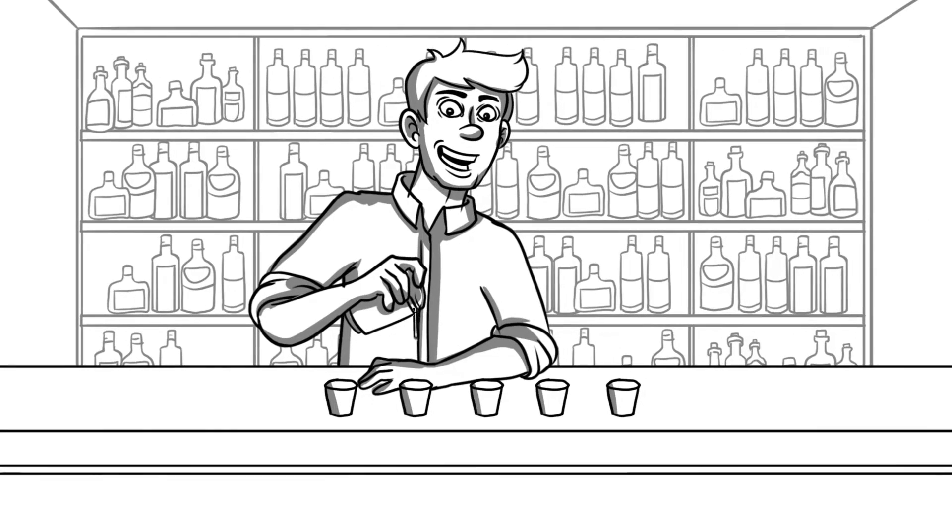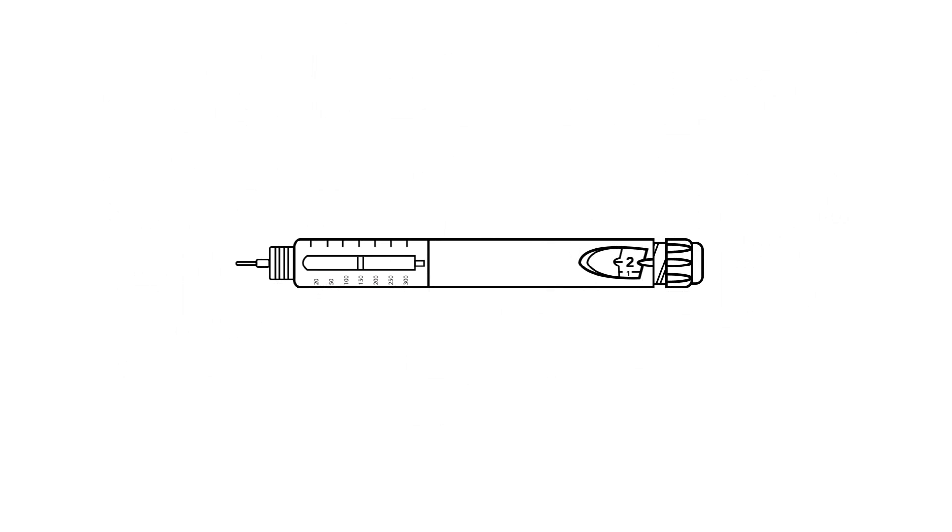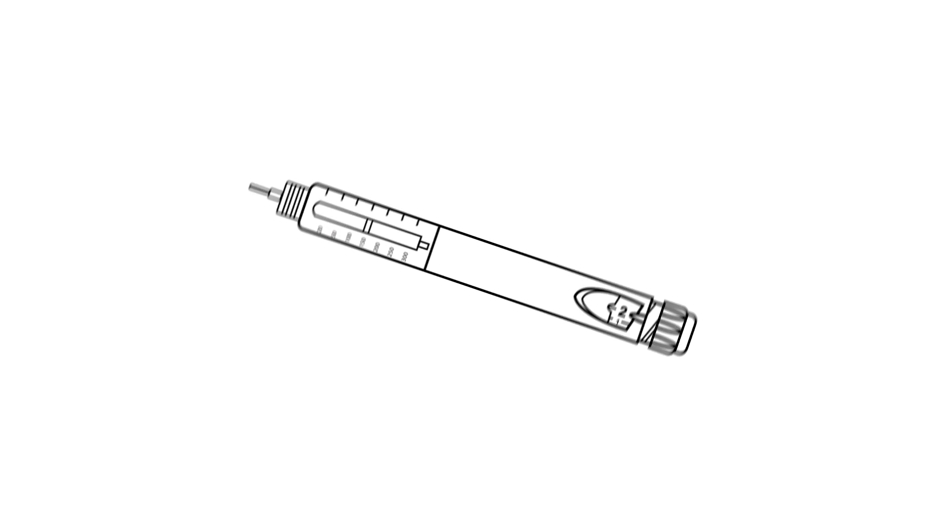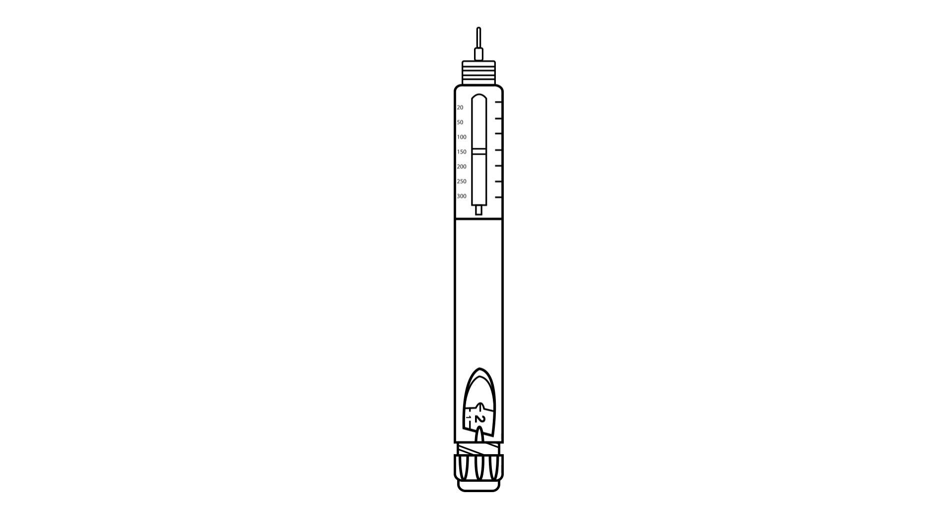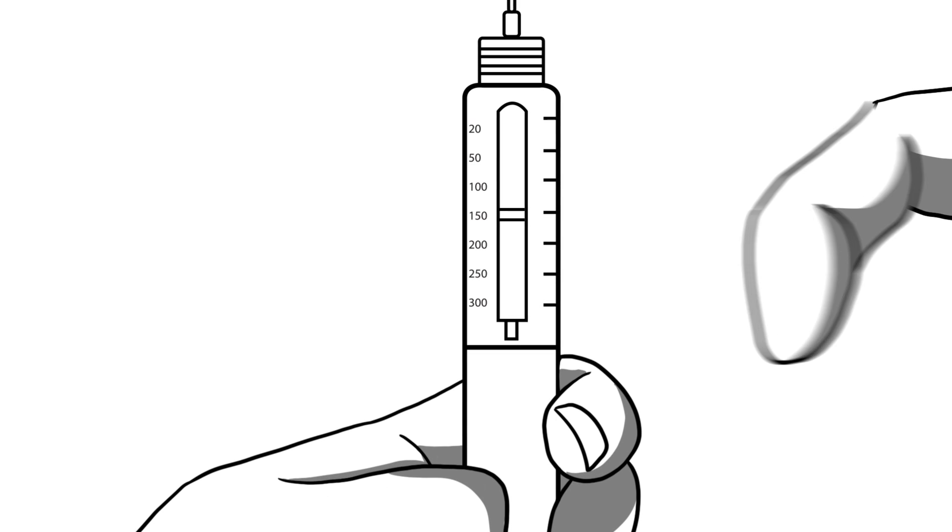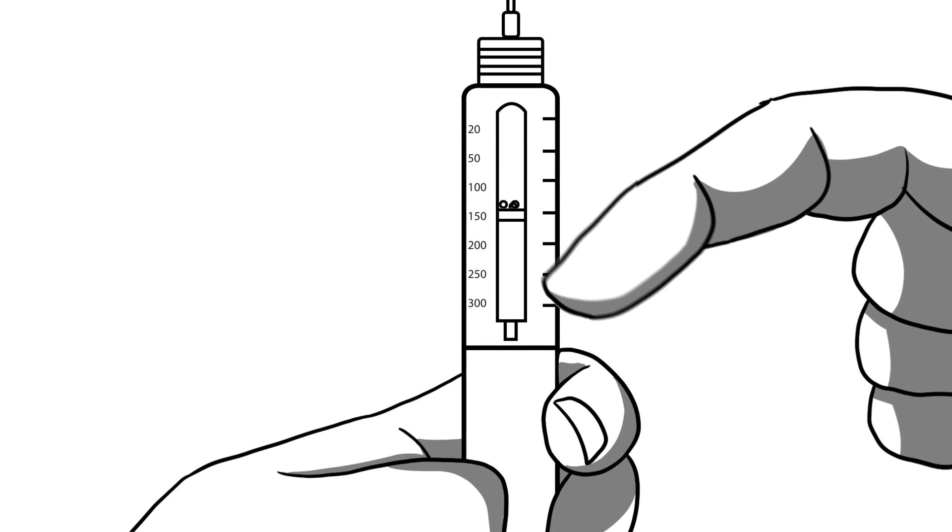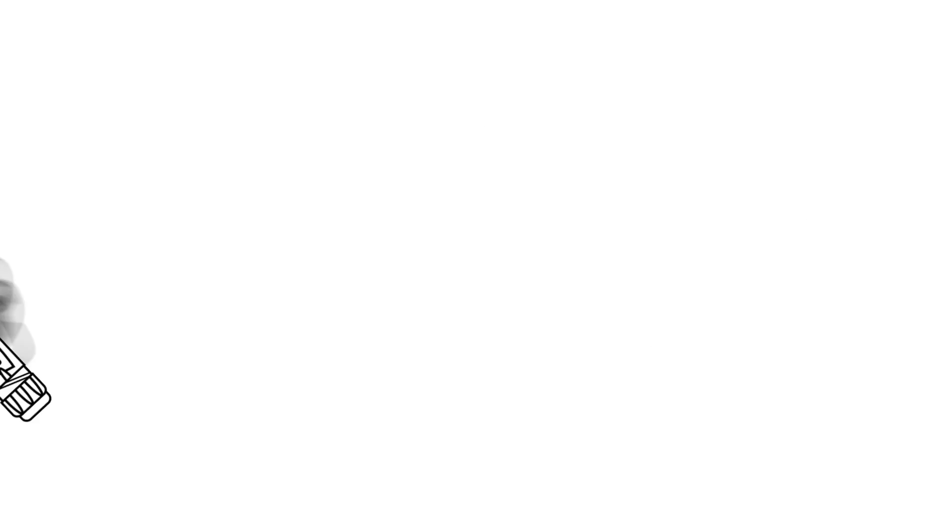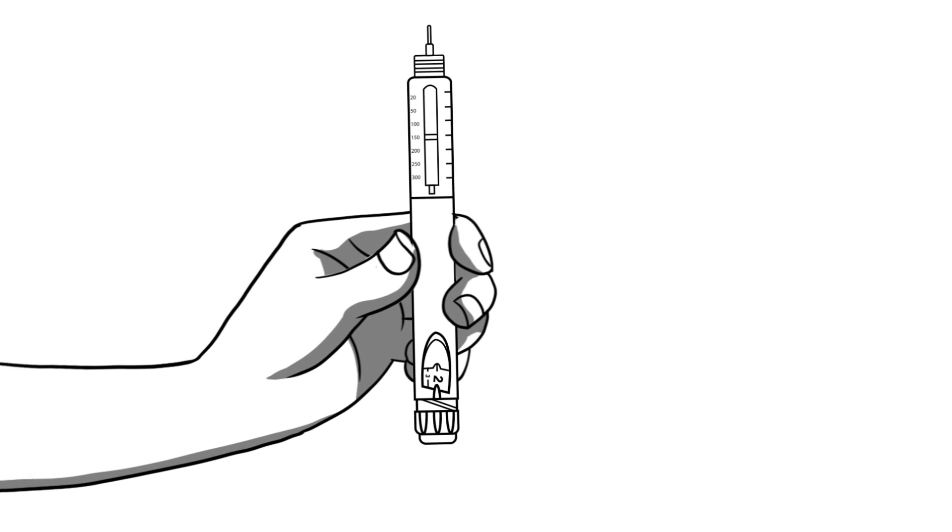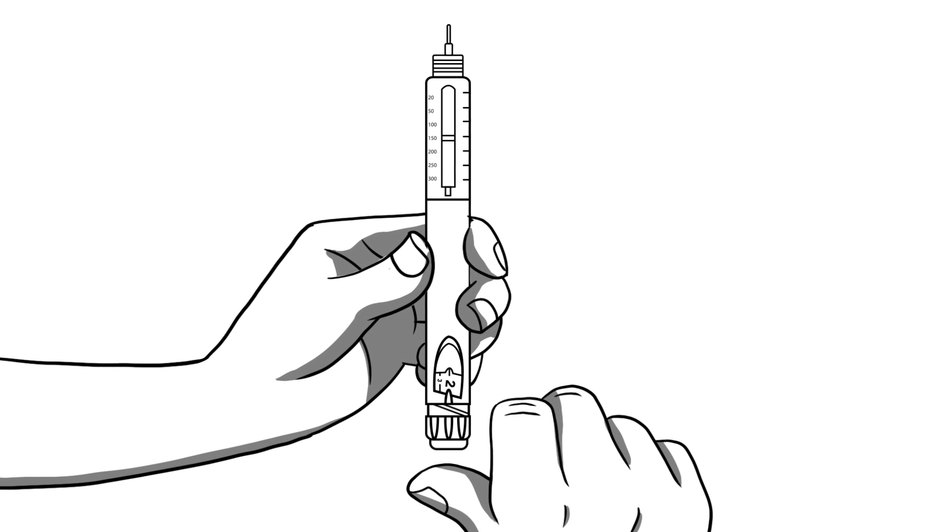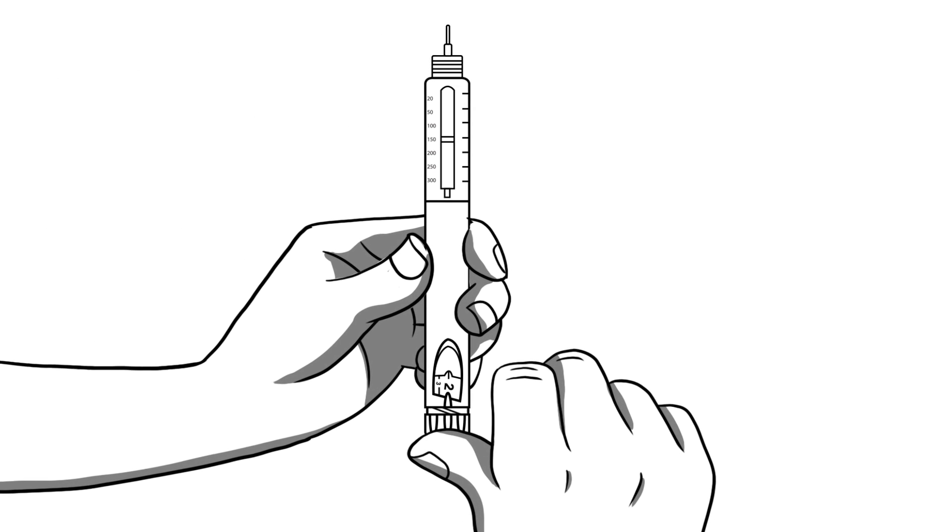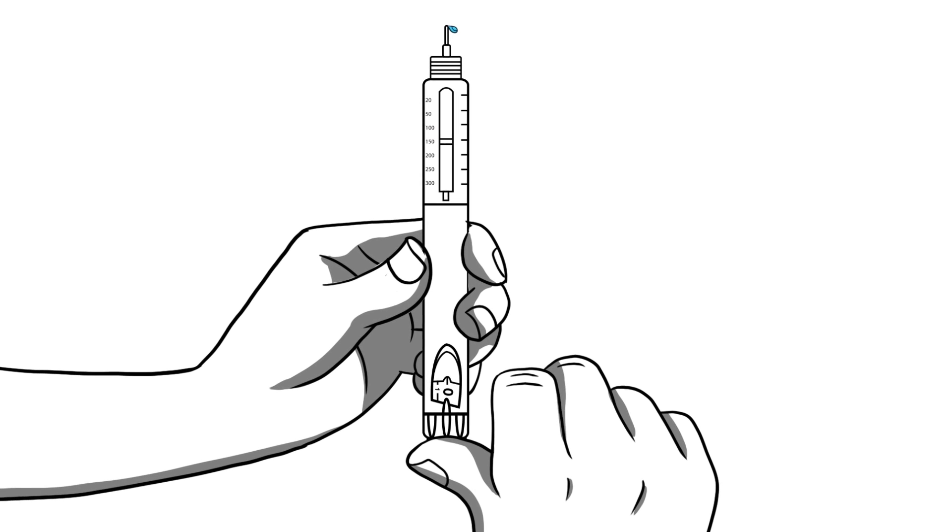Now we are ready for the test shot. Turn the pen upright with the needle facing up. Tap on the clear plastic to bring any air bubbles to the top. Watch the needle tip as you press all the way down on the button until the number in the dose window says zero.